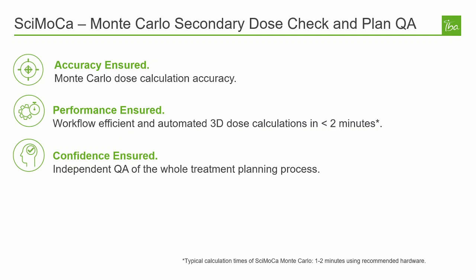Applying SciMoCa as your 3D Monte Carlo secondary dose calculation will increase your confidence in your complete treatment planning process, allow you to efficiently structure your QA measurements, and help to ensure the safety of your patients.